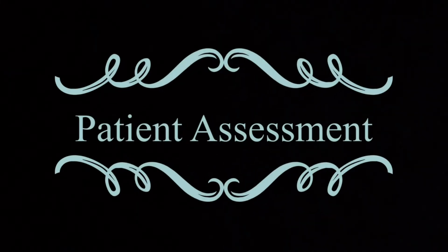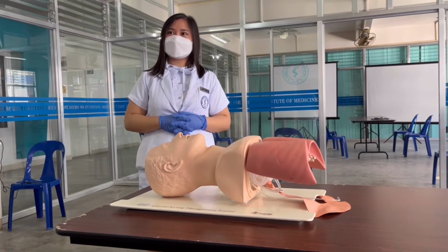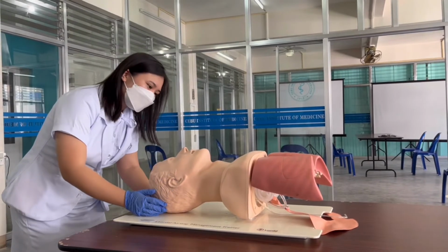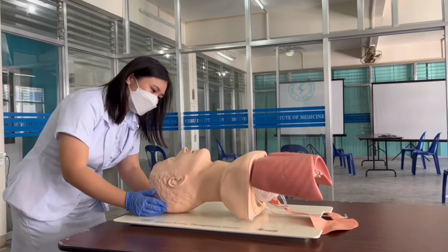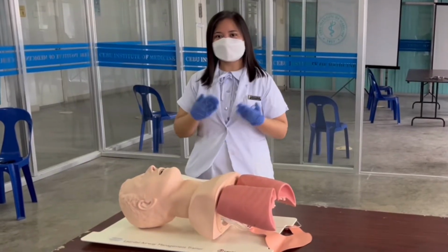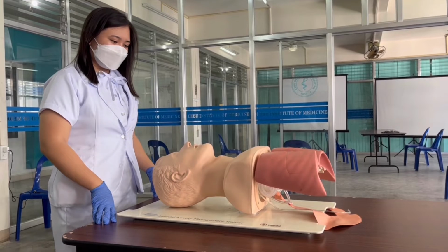Endotracheal Intubation. Patient Assessment. To begin, assess the patient with the help of the mnemonic LEMON. Look externally for signs of difficult intubation such as those with a large tongue, short neck, obesity, dentures, and large incisors. Evaluate the 3-3-2 rule, which is an assessment tool used to predict difficult intubations.